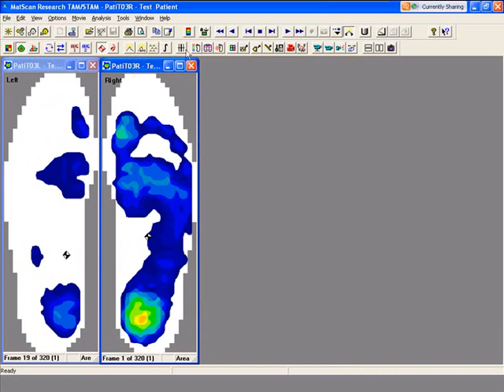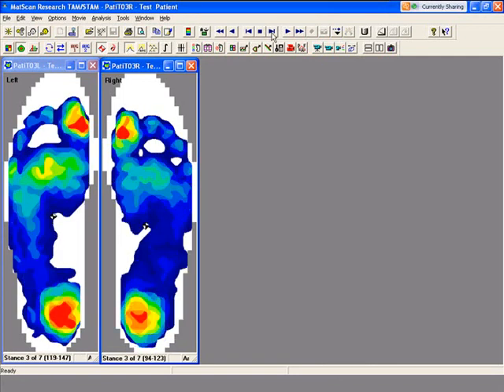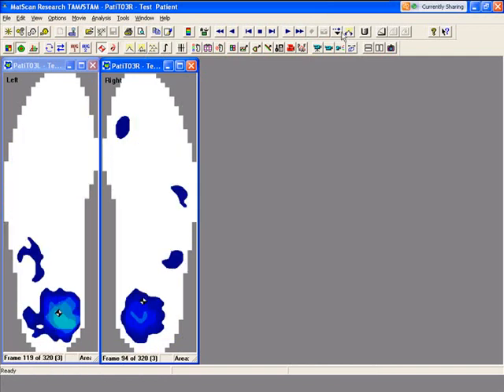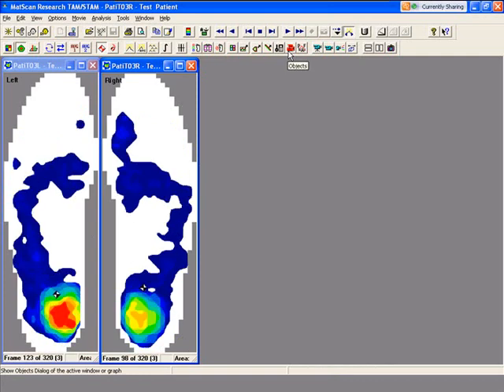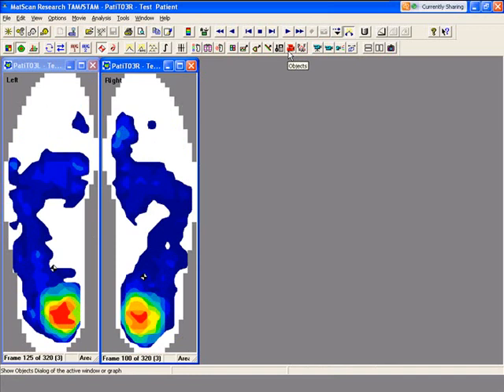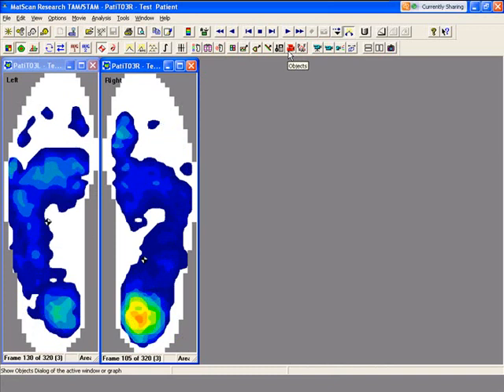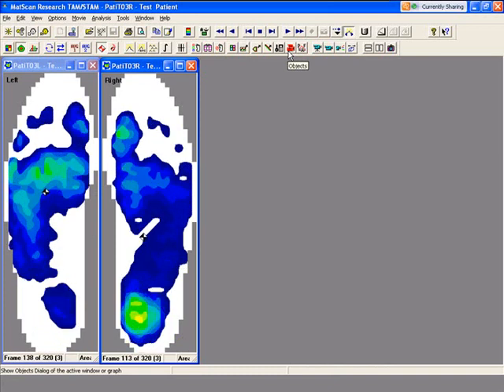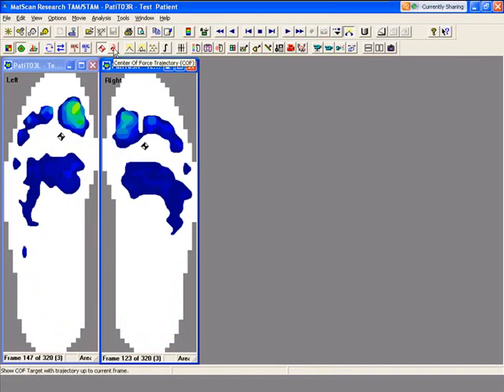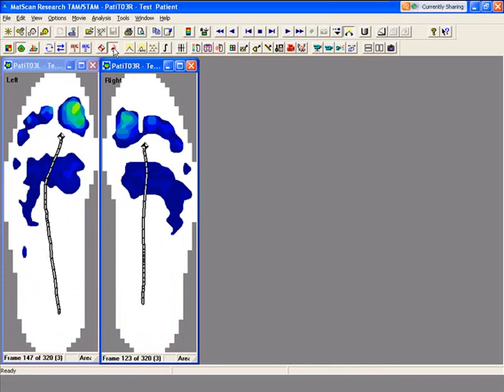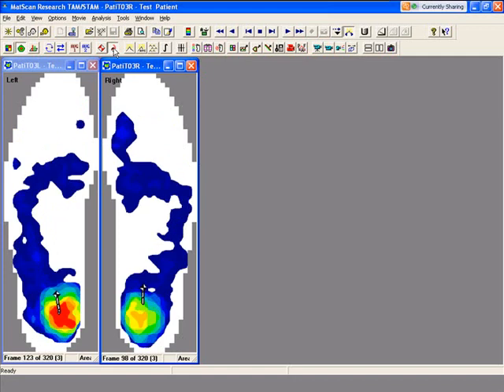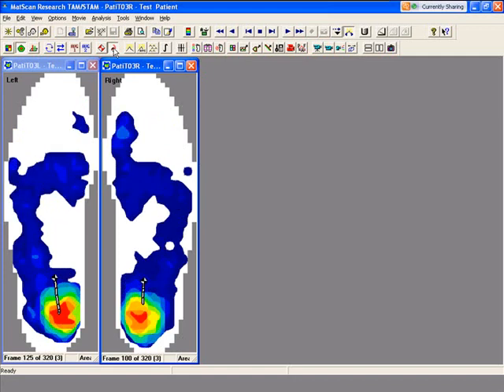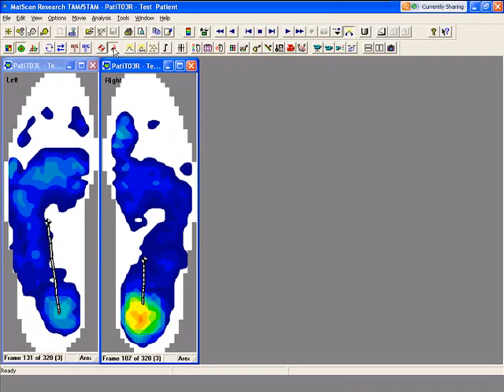What you can also do is track the center of force by taking the peak off and getting to a foot strike for each. We'll look at stance number three of each foot, take peak off, and see if the center of force moves at the same pace on each foot. You can see the foot on the left, the center of force is moving up the foot a lot quicker than the one on the right.